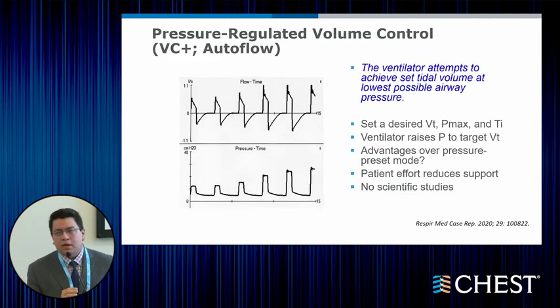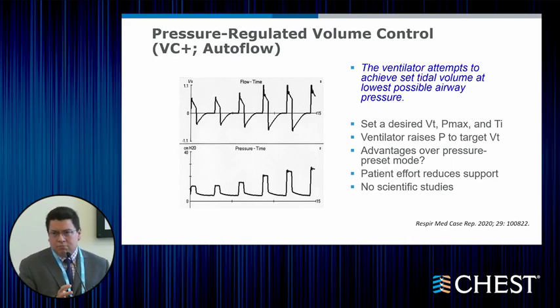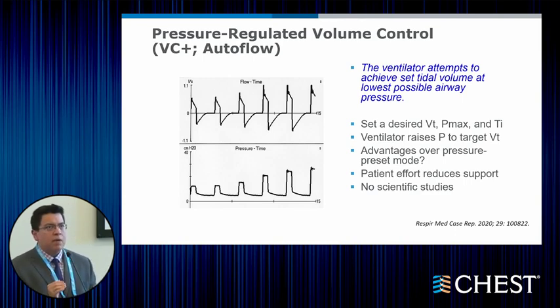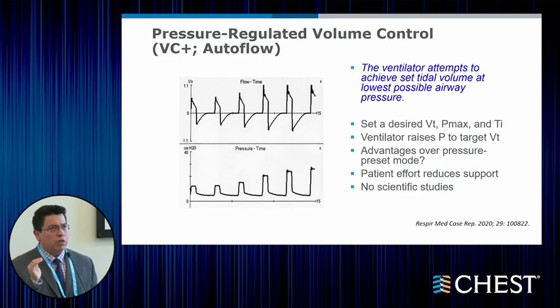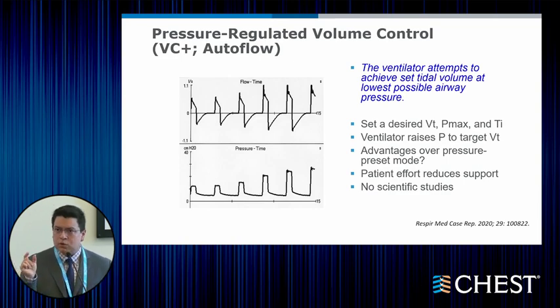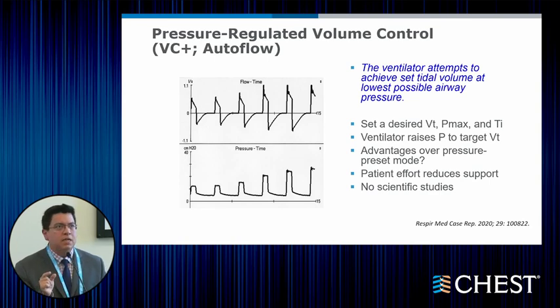So the first one that we will see often and that could potentially be tested on boards will be the pressure-regulated volume control, or PRVC. And basically, it starts as you set a desired tidal volume, and you set a specific maximum amount of pressure support that you're going to use, and you are also able to set an inspiratory time depending on whether the patient is deeply sedated or not.